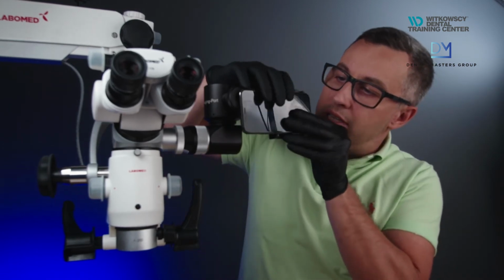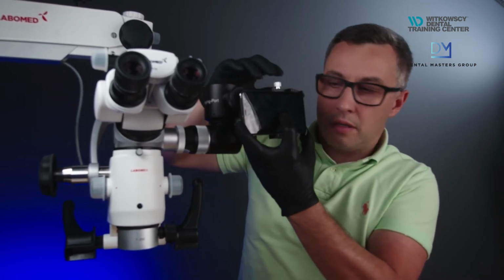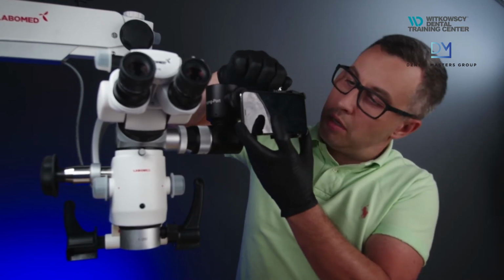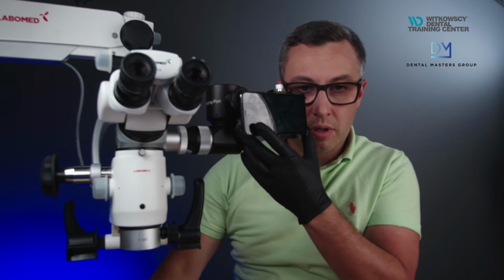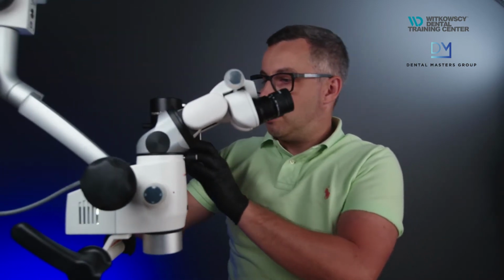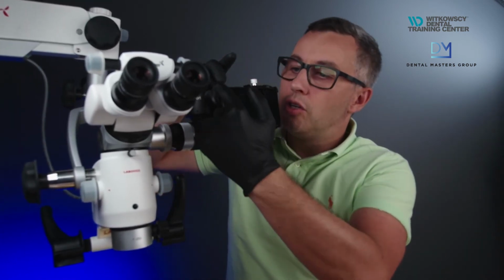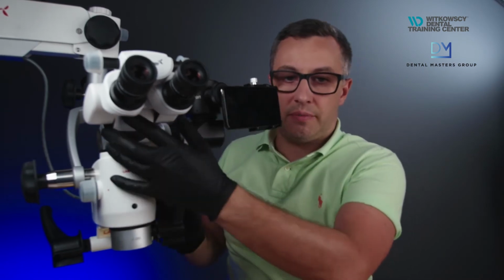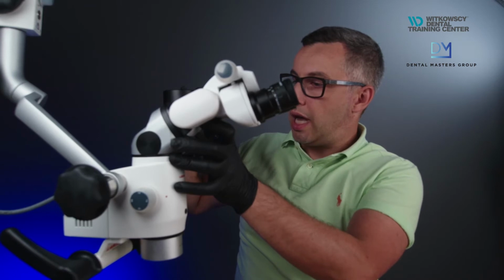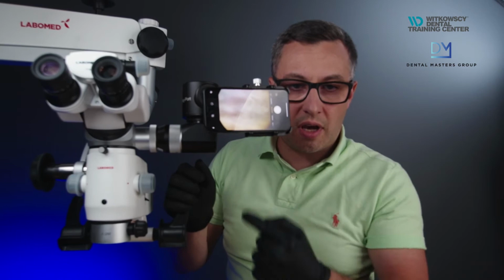So you put the phone inside the socket, like this, and you screw in the position. After you do it, you position the phone so that the lens sees the lens of the adapter. So you turn on the camera, and now you see the positioning here.